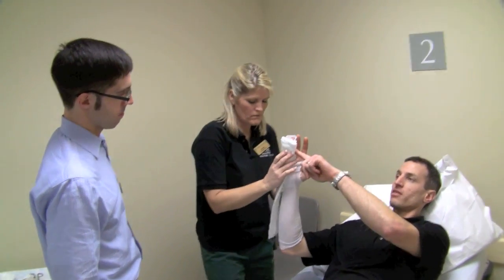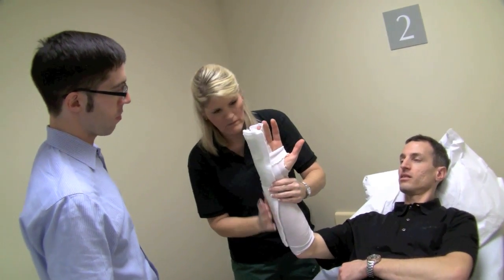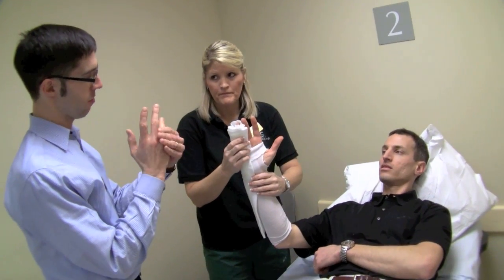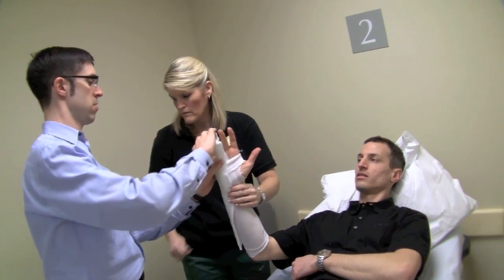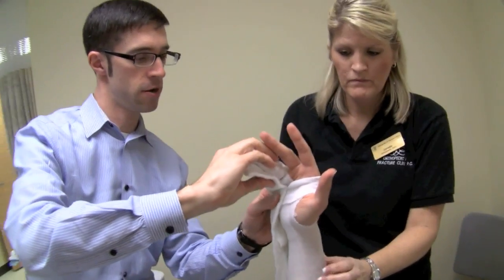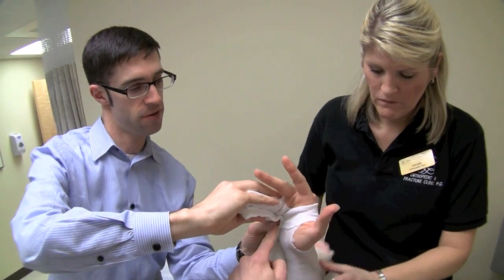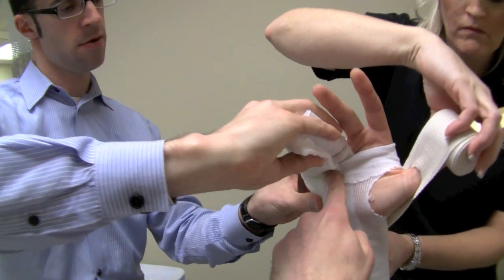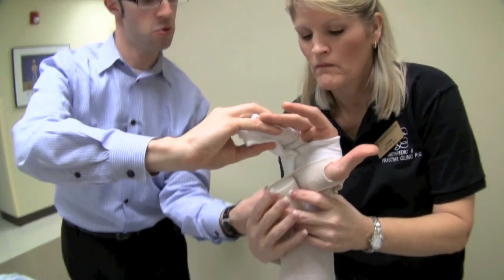Starting up at the fingers, that's our initial point of contact. You can apply it just on the palm side if that's all you need, but it's good to have it on the side where you're folding over so you can get support both on the back and the palm side. Try to get a little bit of extension through the wrist, and as you bring the fingers down, hold those PIPs straight — you can use your thumb to feel where you're flexing right over the MCP.